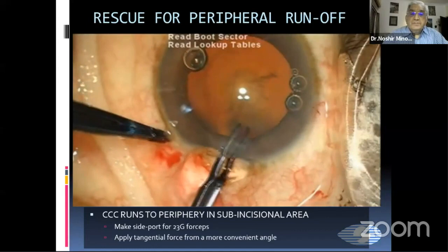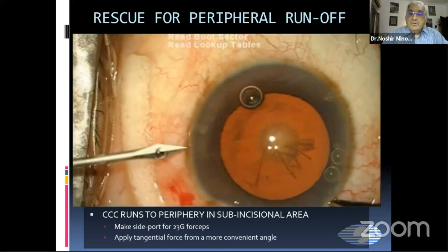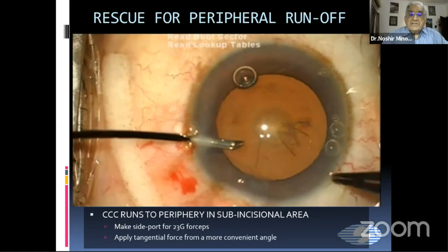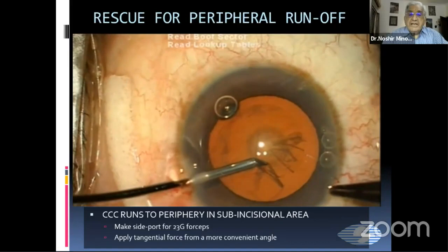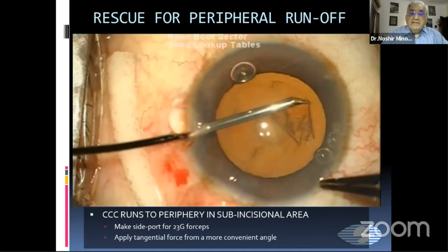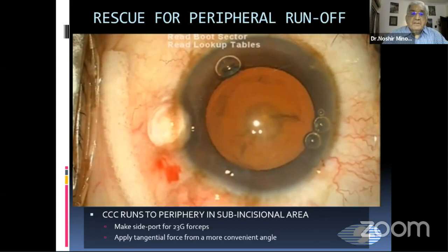I try with the forceps from the main wound, but again this does not work, so I abandon this again. Then I make a side port incision and use my 23-gauge capsular forceps from the side port, which maintains a very adequate anterior chamber, with forces directed tangentially. You must remember that whenever you do this, you should be away from the tearing edge, because if you are near the tearing edge, it will go more to the periphery.